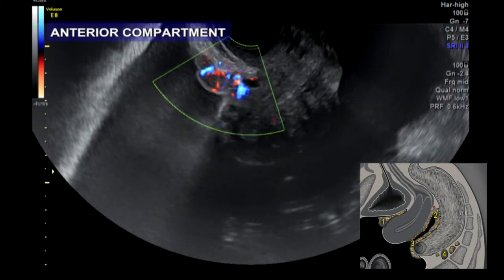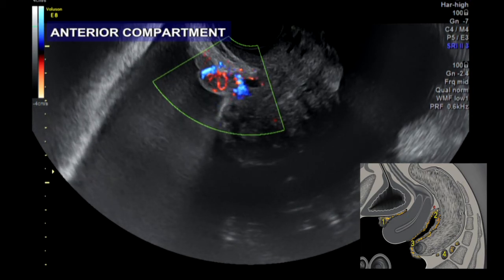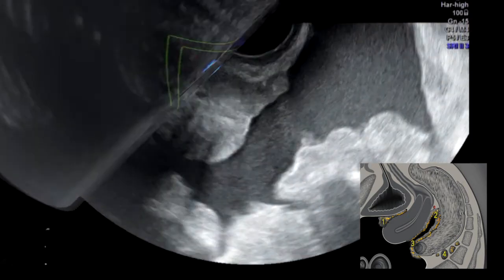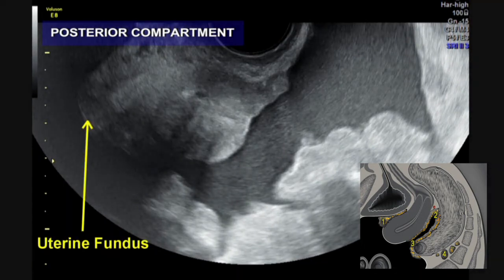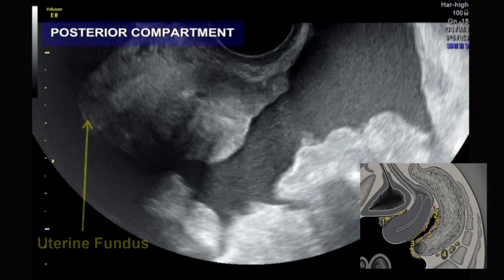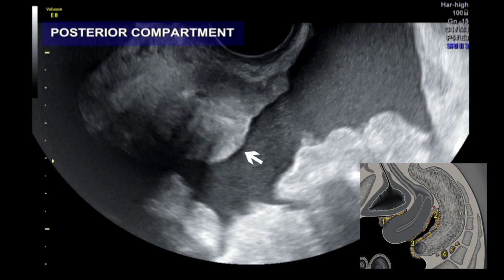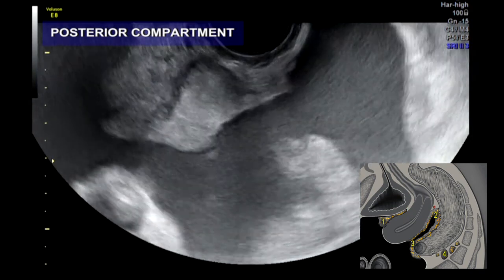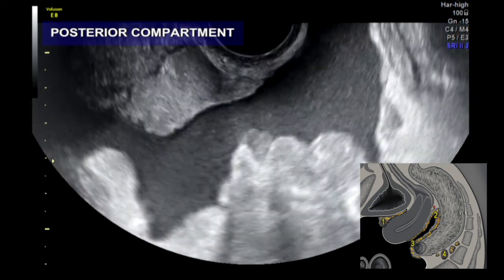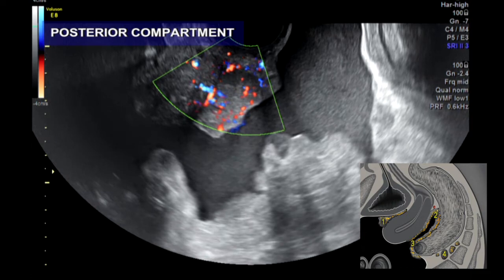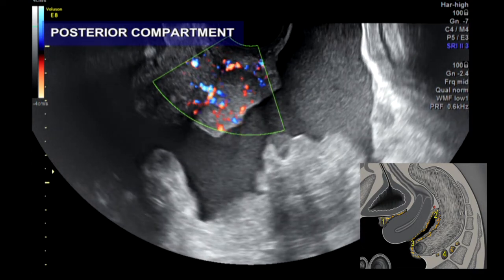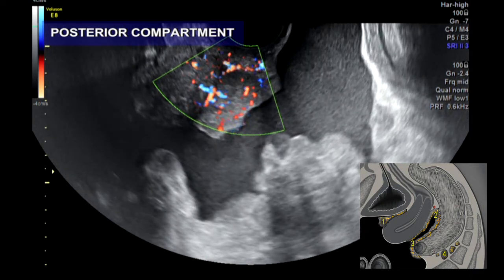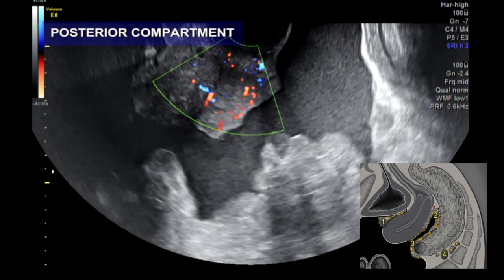The carcinomatosis is typically highly perfused, as we can see here. Moving to the posterior compartment, you can see an implant attached to the posterior uterine wall, infiltrating the sacro-uterine ligament. The carcinomatosis is highly perfused.